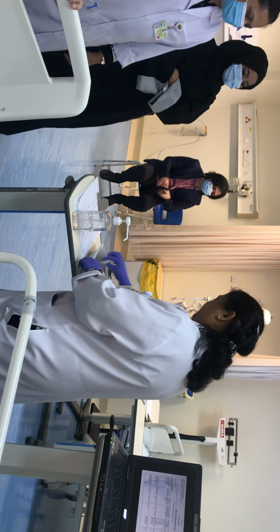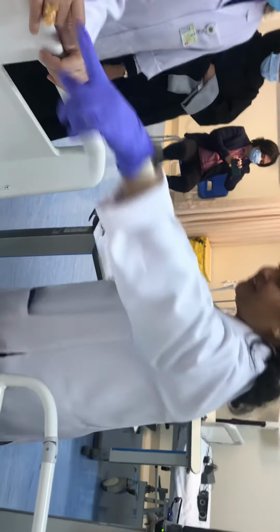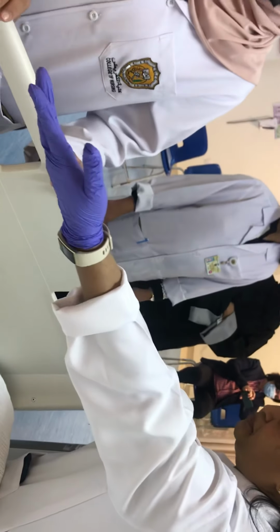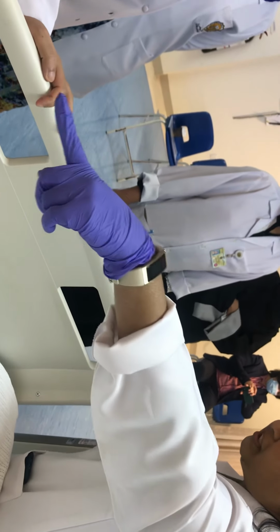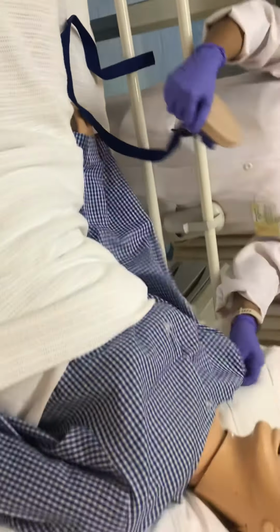So second check I am going to do. Before that, the injection pad. Sorry, just open that oval-shaped pad. Oh, I forgot about it. So if it is in the abdomen, they can tie it around the abdomen. If it is in the hands, they are going to do it differently.